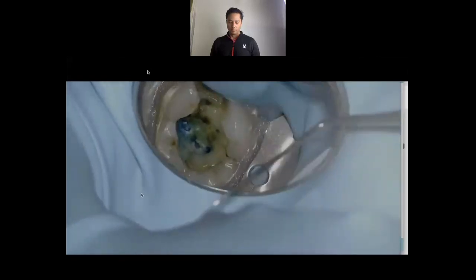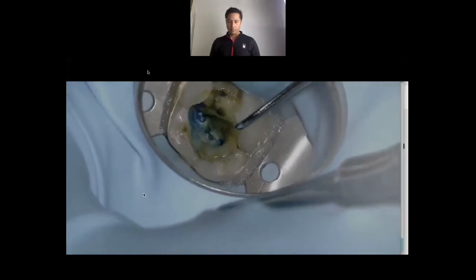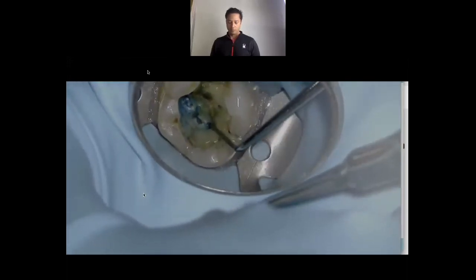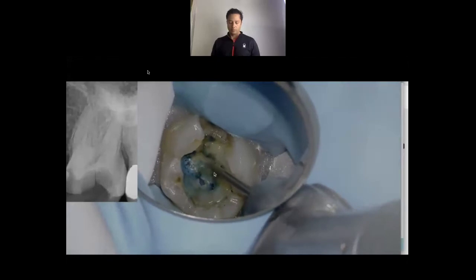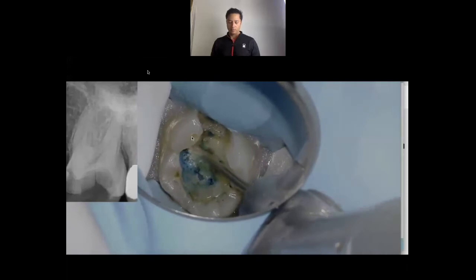We've now used the endo explorer to see if that calcified material is soft or not — no, it's definitely calcified, and that's where the stain resided. So I'm going to use this long shank Muntz bur — this is a number two — and I'm just going to run back and forth. I'm picking a spot between the mesial buccal cusp and the palatal cusp, and making a line back and forth. The tooth is actually not that calcified, so it's going to be pretty simple to get into it.